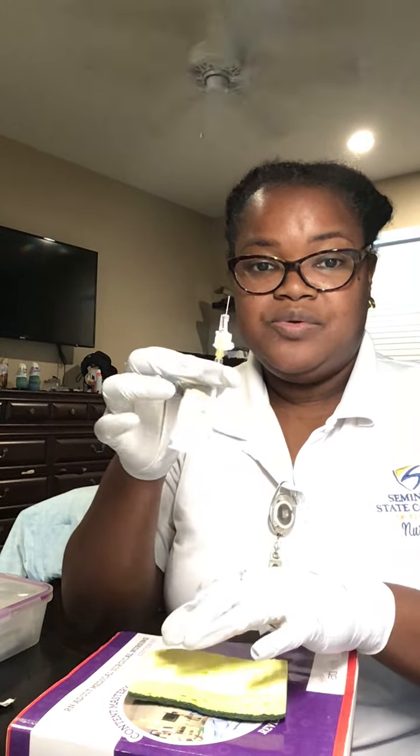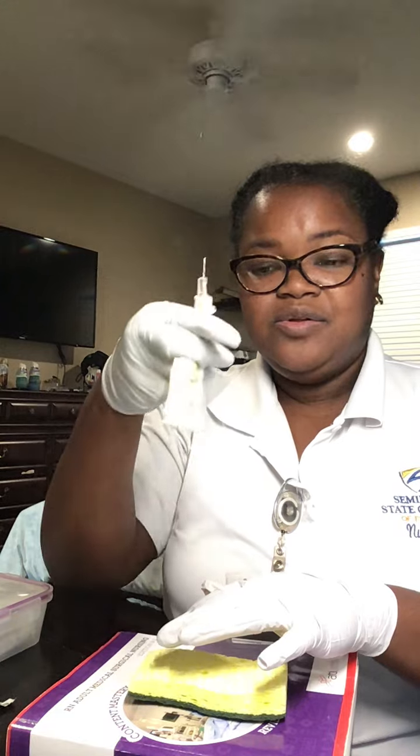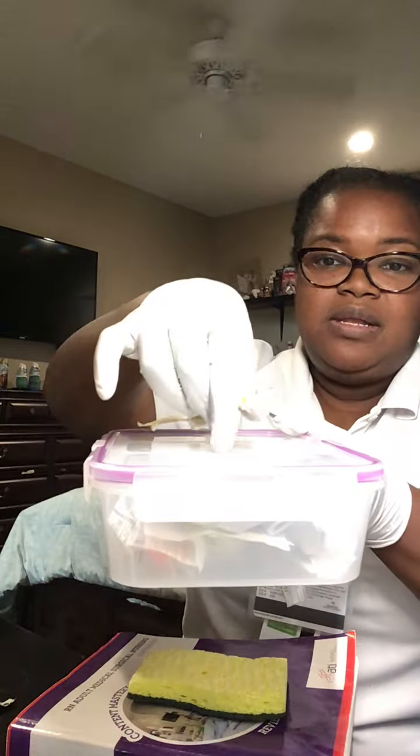I just put a gauze on the top. I don't have to rub it. Okay, I'm not going to secure the safety because I'm running out of supplies. For safety, I'm going to dispose of the needle in my needle container. No recap.